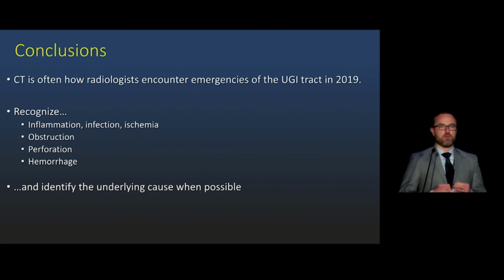So to conclude, we usually encounter upper GI emergencies on CT these days. So our job is to recognize these entities that can cause this presentation and identify the underlying cause when possible.